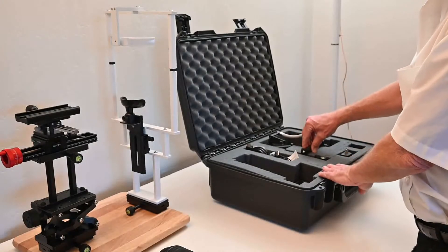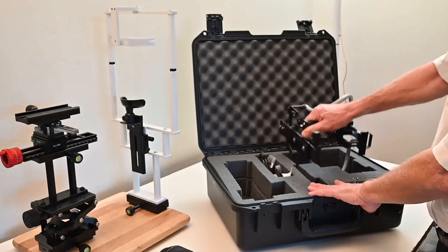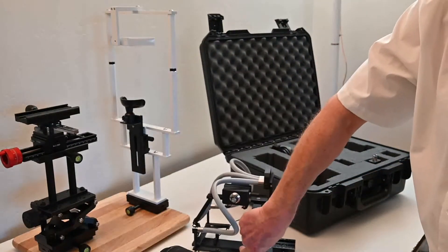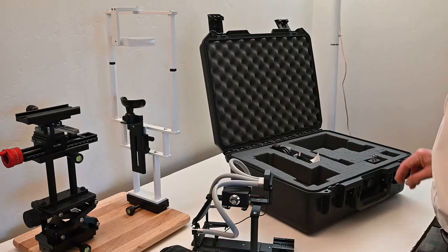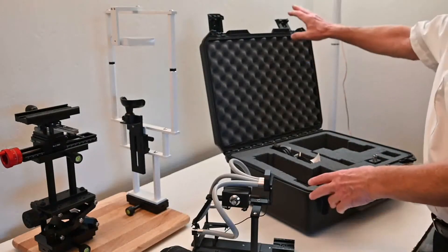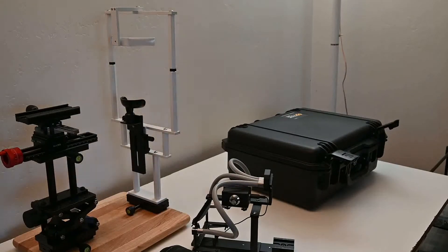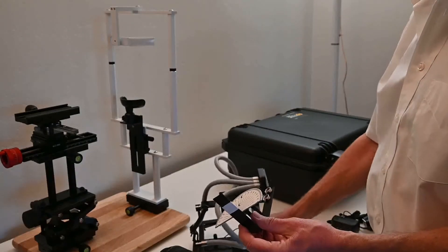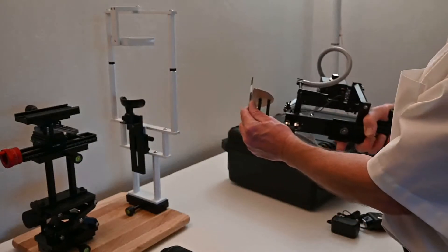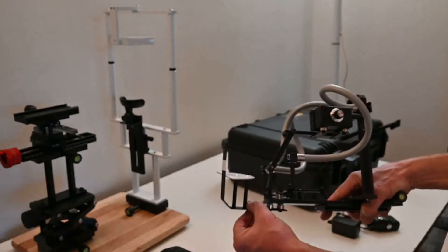The second step is to grab the illuminator — you can hold it by the handle, lift it straight up, and set it down. This is the new three-channel illuminator. The last items needed are the alignment target and the electronic flash. The alignment target is important for getting the light angles just right.